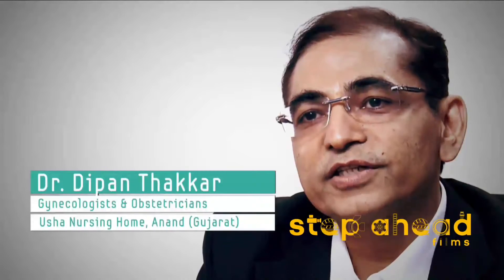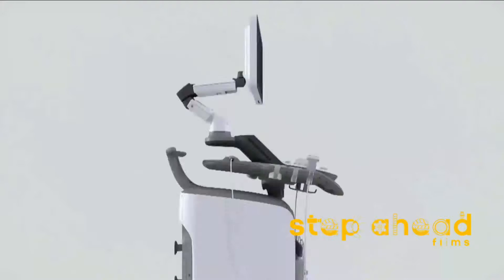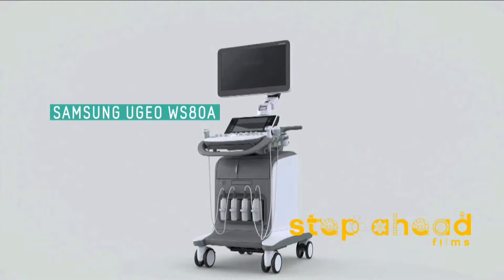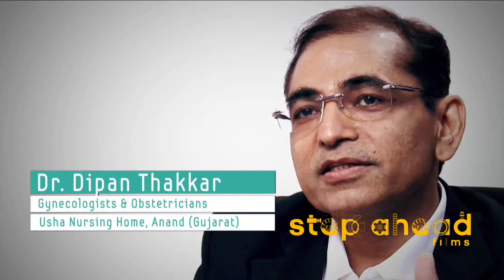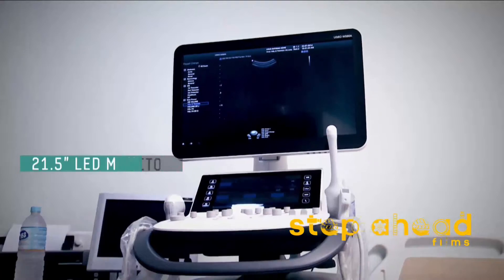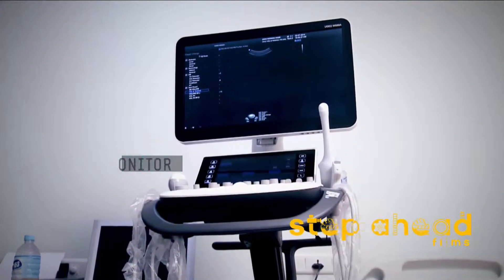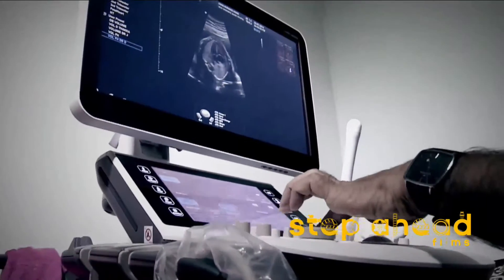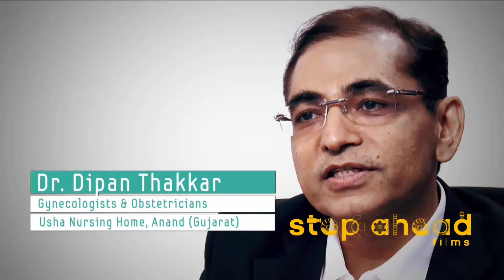I was a user of a 3D-4D unit from Siemens before I bought the WS-80A from Samsung Electronics. What attracted me to this unit is its spellbound presence — the 21.5-inch LED which gives a crystal clear image, and it is really very soothing to your eyes. You are not exhausted even if you scan for 6, 7, or 8 hours.